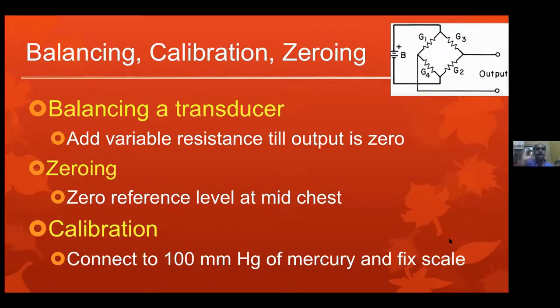Okay. The mid-chest level in the normal heart, from the anterior surface to the posterior surface, very often lies at the level of the right and left atria. Since most of the hemodynamically significant measurements, like when you are doing thousands and thousands of cath, what is the majority of the heart problem in the world? Heart failure.